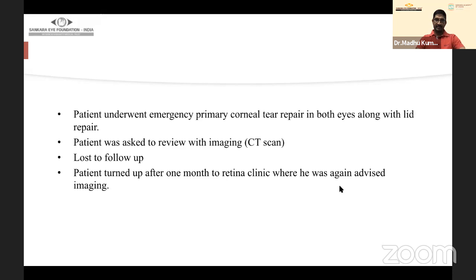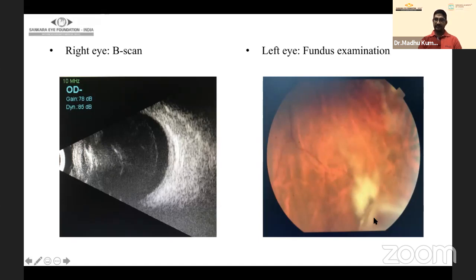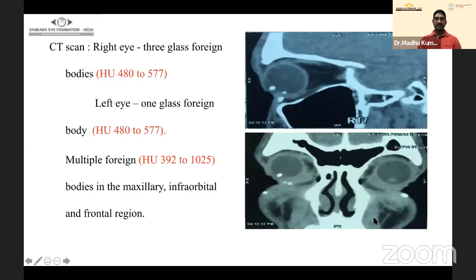In such cases we do a two-step surgery: primary repair first, then second-step surgery between one week and 14 days later. This patient was lost to follow-up and returned after one month to the retinal clinic. Imaging showed foreign bodies in the right eye and the left eye fundus examination showed a glass foreign body with some vitreous hemorrhage sitting inferiorly.